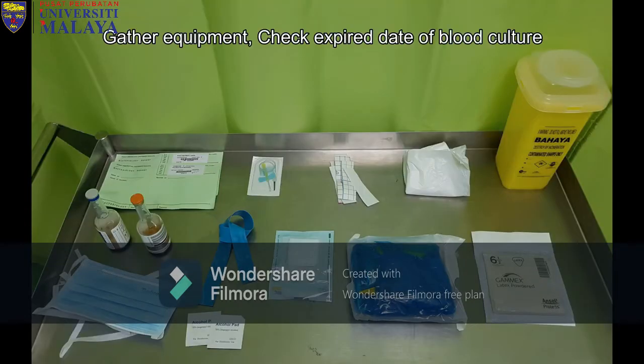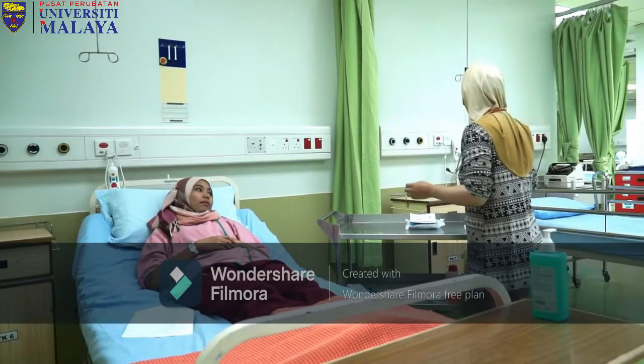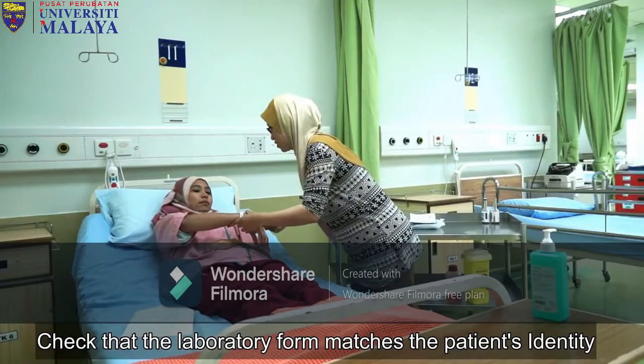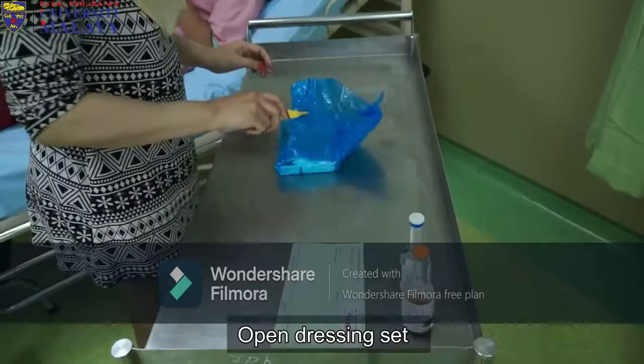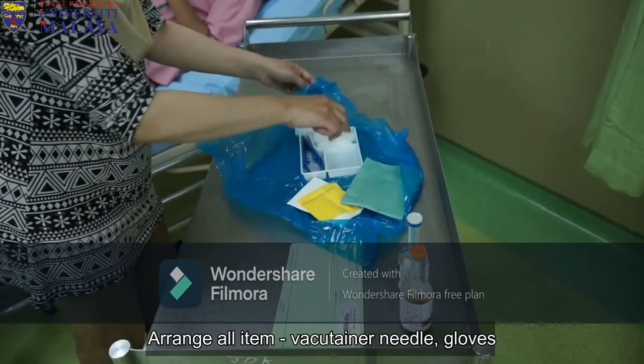Gather all equipment and check the expiry date of the blood culture bottle. Introduce yourself to the patient. Check that the laboratory form matches the patient's identity. Perform hand hygiene. Open the dressing set. Arrange all the items including needle and gloves.